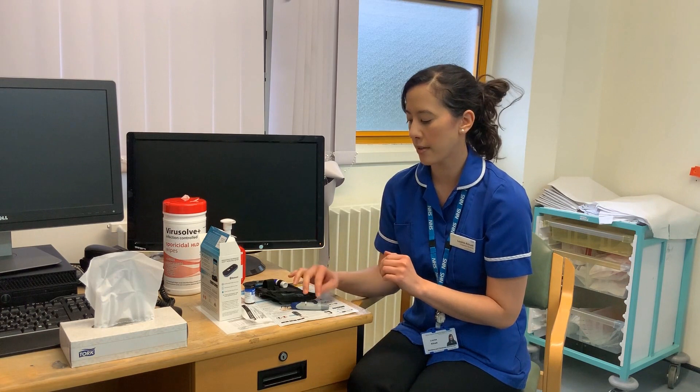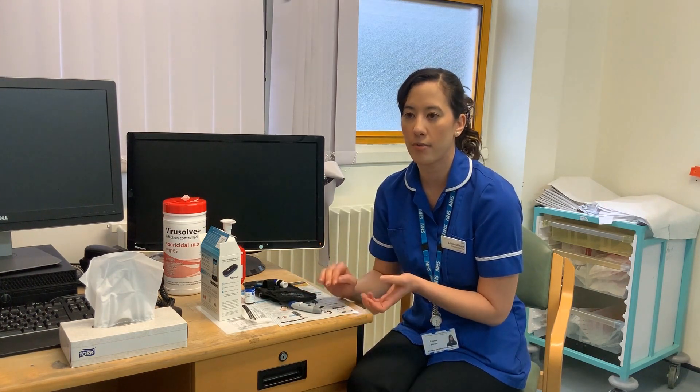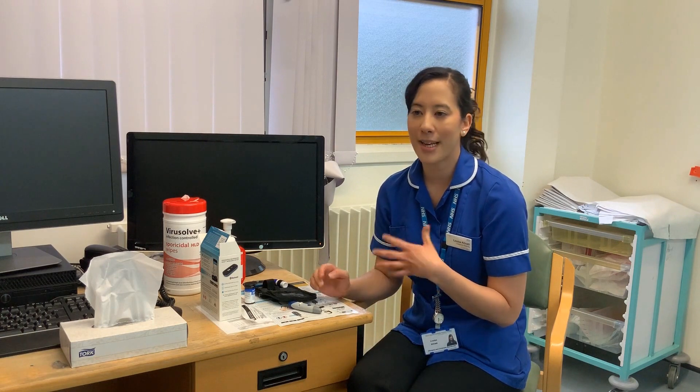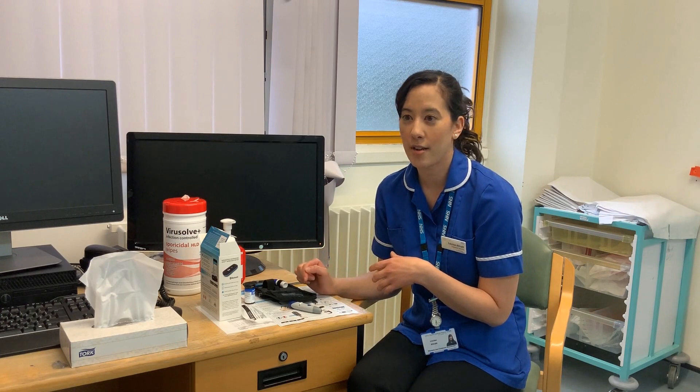Before you do any testing, we recommend you must always wash your hands first — usually with just water, but if you're using soap, make sure that you rinse it really, really thoroughly. Just because anything that you've touched, including things like lotions and alcohol gel, can affect the reading and the result.